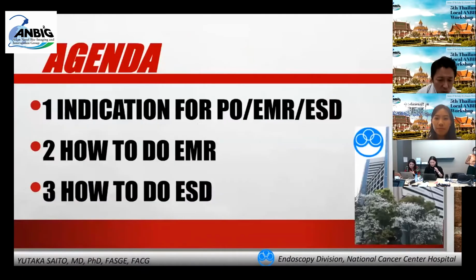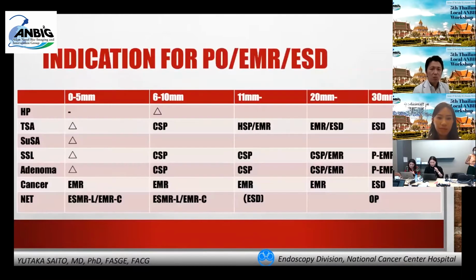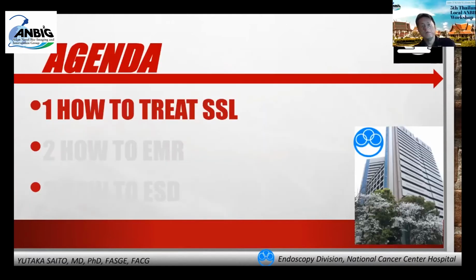First of all, I'd like to talk about the indication for polypectomy, EMR, and ESD. The indication for the endoscopic treatment strategy could be based on tumor size and histology. And first of all, how to treat SSL-related lesions.